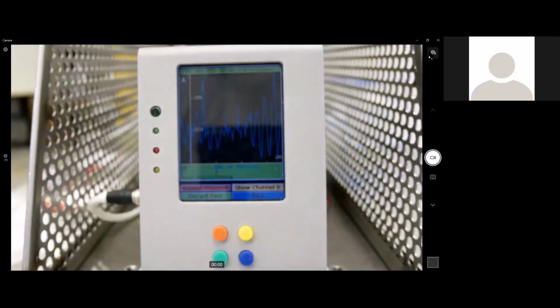So this is basically the whole setup for conducting a mouse ERG. To run through it real quickly, we want to make sure we have all the equipment that isolates the noise. We want to keep the temperature of the animal consistent. We want to keep the isoflurane consistent, or I should say the anesthesia consistent. Depending on your lab, you may use ketamine, xylazine. Other labs, isoflurane is standard.